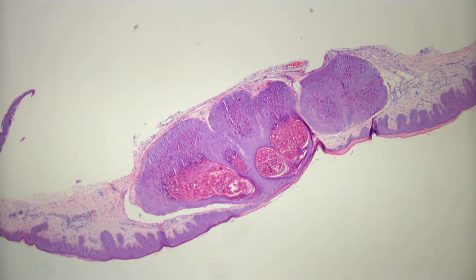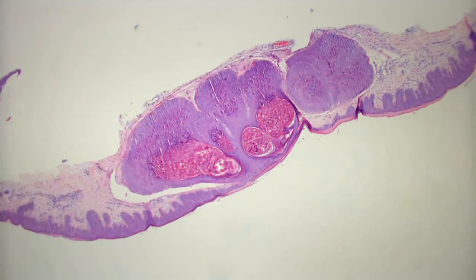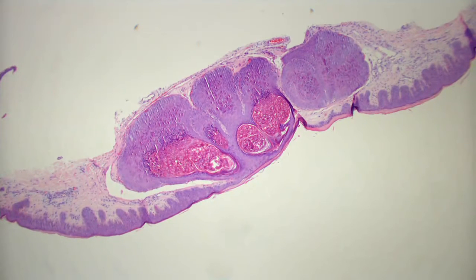What are some other items in the differential diagnosis of this clinically? Crypto, histo, good. Cocci, possibly, it'd be a little unusual. There's one or two others. What if they came from Thailand? Penicilliosis. What if they had a pneumonia that looked like bubbly Swiss cheese on the biopsy that was positive with GMS? What's the type of pneumonia that HIV-positive patients get? Pneumocystis. And that actually can sometimes cause molluscum-like lesions. And we actually wrote that up a long time ago.